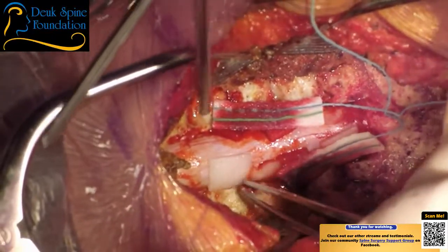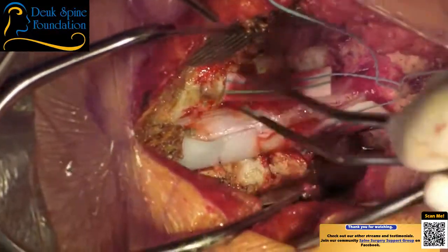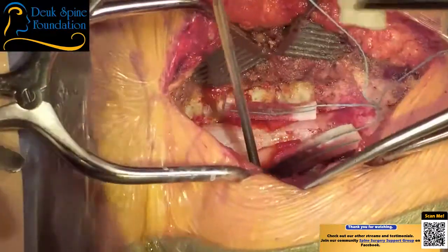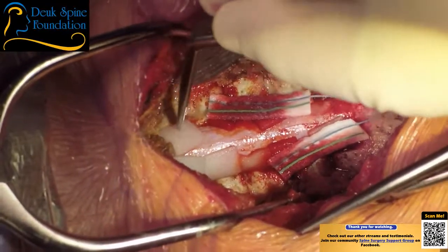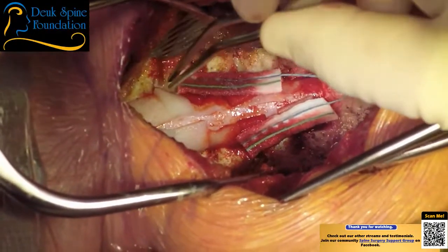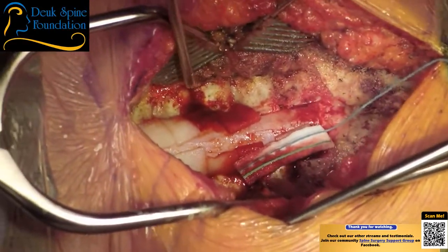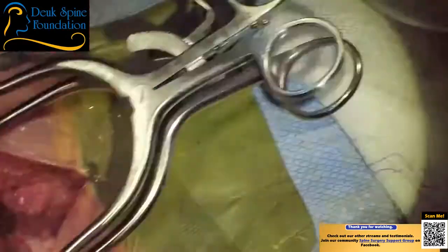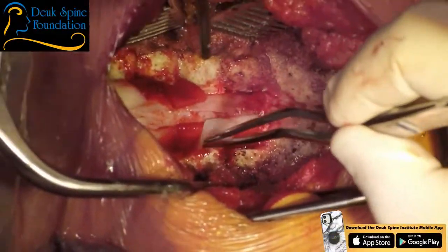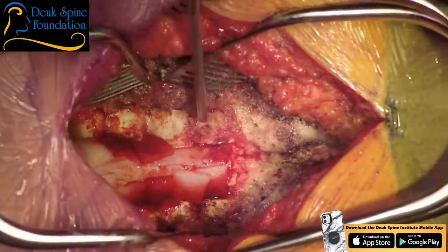Now we're going to put our screws in. And some surgeons will use fluoro. I don't. I was trained not to, and trained how to do it without fluoro. That said, I've never had a nerve injury or vertebral artery injury ever. And the key is where you start your pilot hole, and it's your trajectory. And of course, you have to compensate for rotation of the spine. And we're also monitoring just in case, which, you know, we're monitoring EMG, MEP, SSEP.